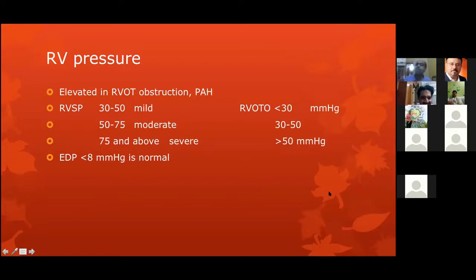How to know the level of obstruction? You pull back from the main pulmonary artery. We will complete the pulmonary artery and then come to this question. That is something simple, not very difficult. If you are able to demonstrate with an end hole catheter, when you are seeing the pulmonary artery, you are having a pulmonary artery systole and diastole. That means the diastole is actually not touching zero. And then you come to the right ventricular outflow tract. In the case of infundibular stenosis, the right ventricle will touch zero. So you have started having ventricular trace, and that means it is subinfundibular, infundibular pulmonary stenosis.